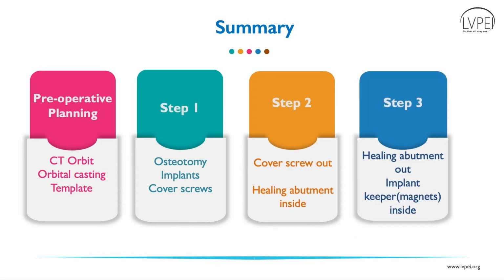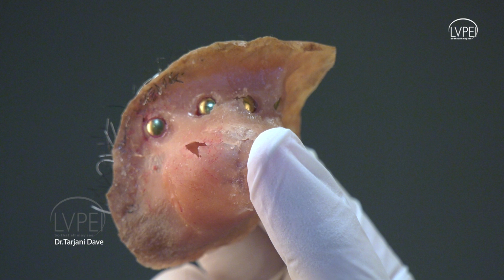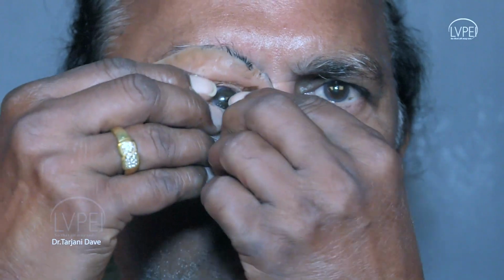Despite its expanded use in oral maxillofacial, ENT and orthopedic surgery, it is often an overlooked reconstructive option for the orbit. This can be an excellent orbital reconstructive option in carefully selected patients. The complication rate is low, the implants are well tolerated, and both the implants and prostheses require minimum long-term maintenance after the early post-operative period.